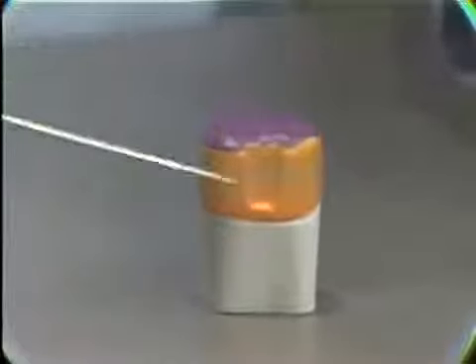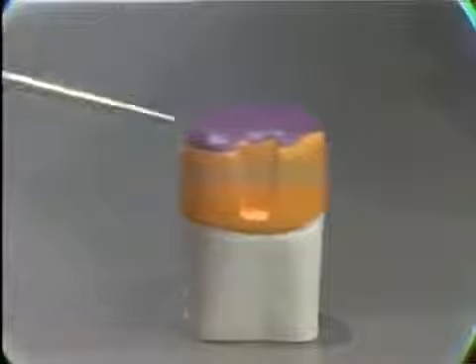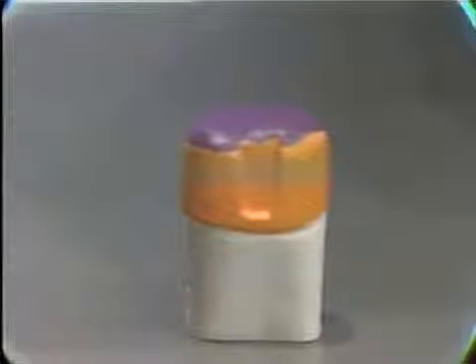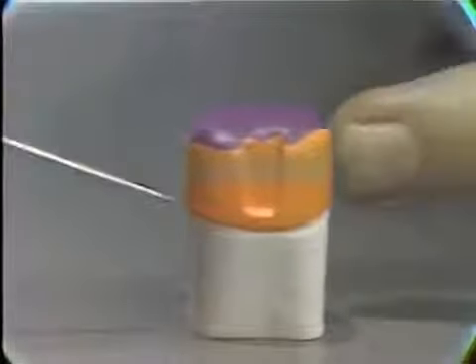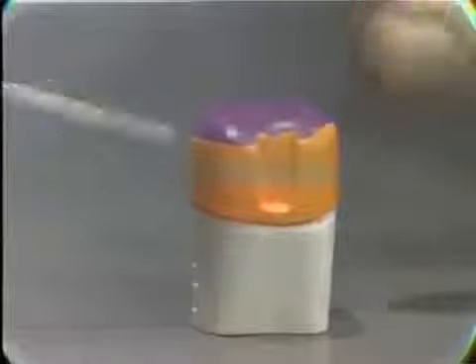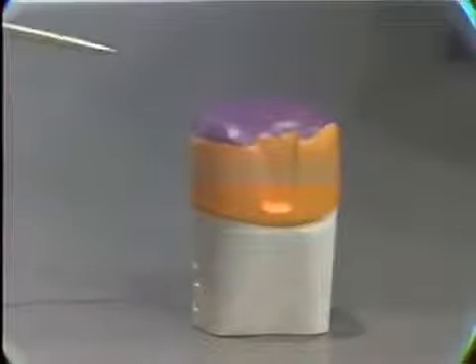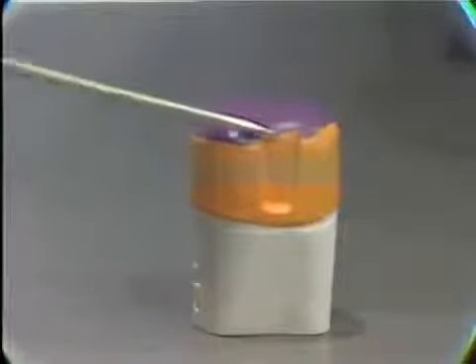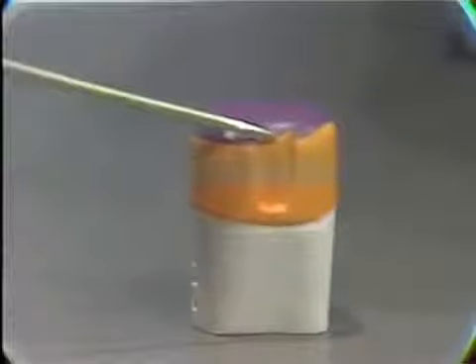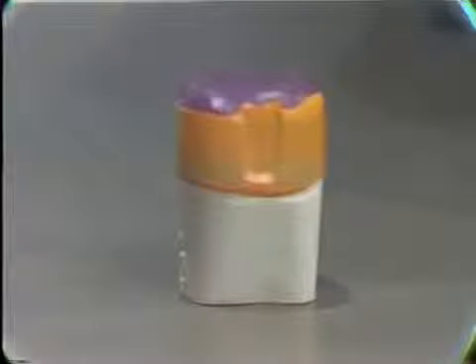And here again you've got the maximum retention, all of the axial surfaces contributing towards the retention of this type of preparation. Where this may have perhaps excess taper, which it doesn't in this one, or where the clinical crown is very short, as is sometimes the case in a mandibular molar tooth, additional retention can be obtained by placing boxes or grooves on the proximal surfaces, on the buccal or lingual, or on the mesial or distal, or in all of these situations.